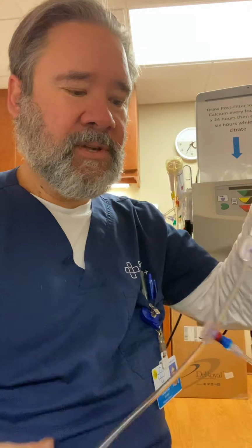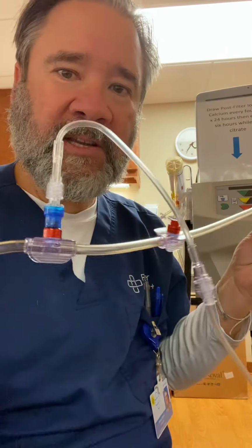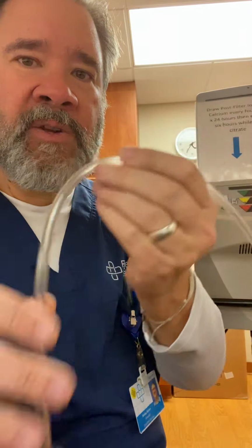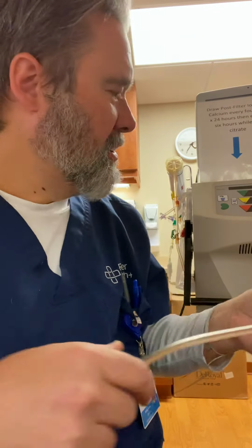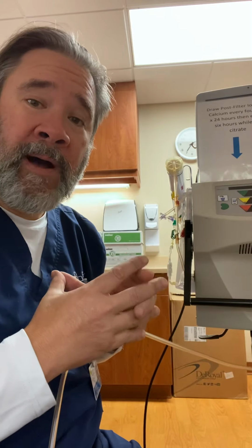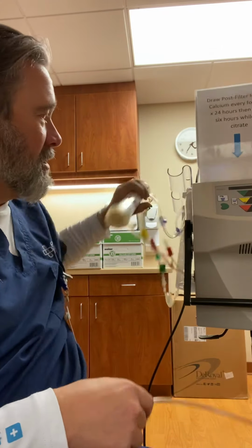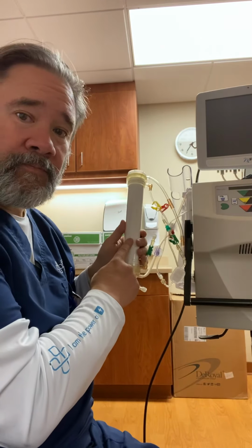It's at the first access port, because we want this to mix as long as we can down the dialysis catheter until it gets to the filter, because that way the mixing will bind with the free calcium, and you will not be likely to form a clot inside the filter, which is the goal.